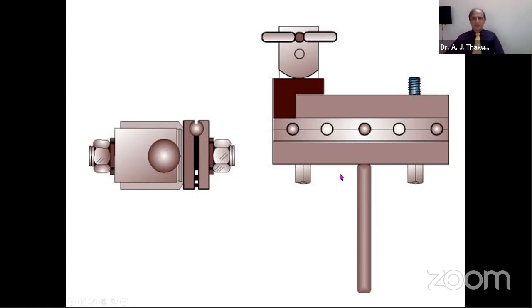It's very efficient. This is also very efficient with newer additions. They have put in ball bearings here. With that, these balls can also be turned. So both the systems are very efficient and very well worked out. Once we give engineers some problem, they really work it out and make our life extremely comfortable.